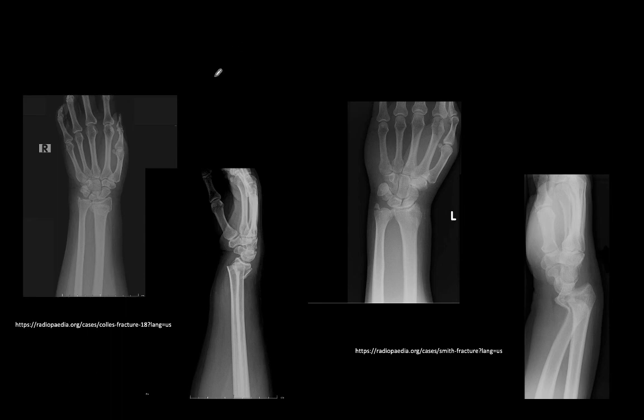So we'll note in the case off to the left, which includes a PA wrist and a lateral wrist off to the right of that image, you'll notice the distal radius is fractured. It's really a metaphyseal fracture. But before we decide if it's a Smith or Colles, we have to note which direction the fragment went. So when we look on the lateral views, let's identify what's ventral.